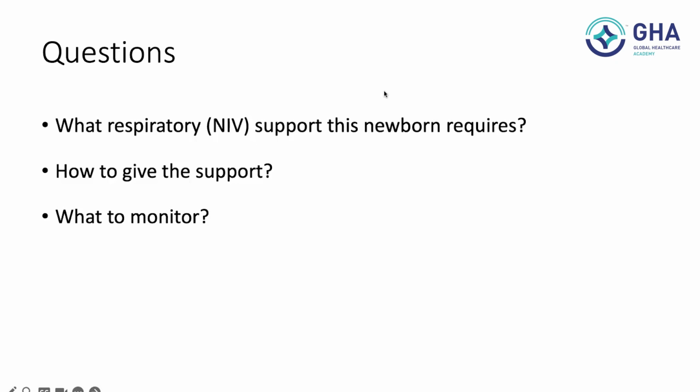Very good, very good. I'm so happy. All of you are saying CPAP and not ventilation. So this is a typical baby who requires CPAP. CPAP is continuous positive airway pressure, which is given through the nostrils to keep the alveoli open and to decrease the work of breathing.